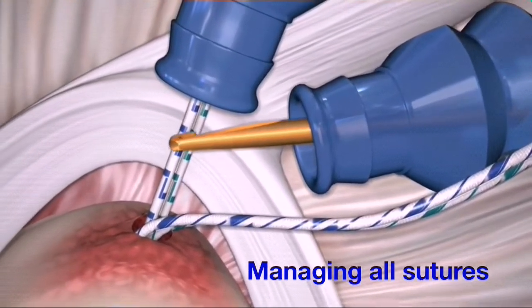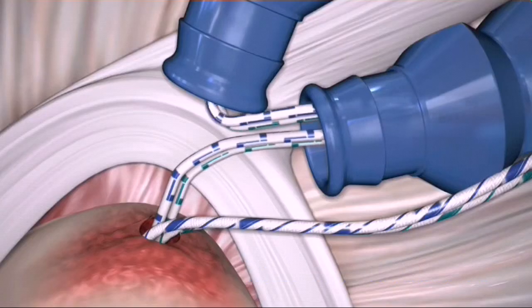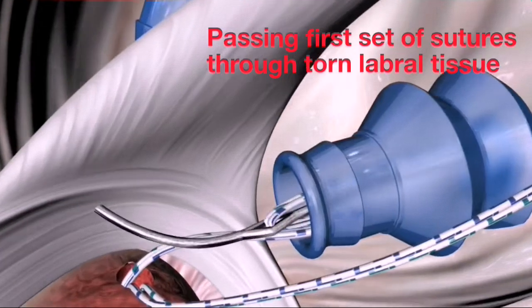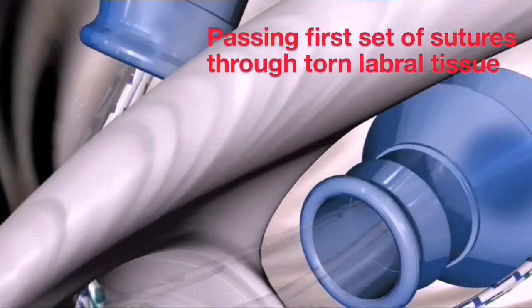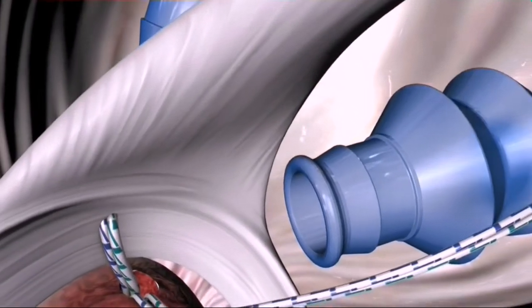Pull the remaining two suture limbs closest to the labrum into the same anterior mid-glenoid cannula. Use a spectrum crescent hook and super shuttle relay to pass two suture limbs from the anterior mid-glenoid cannula through the labrum, directly behind the center of the biceps tendon attachment and out the anterior superior portal.